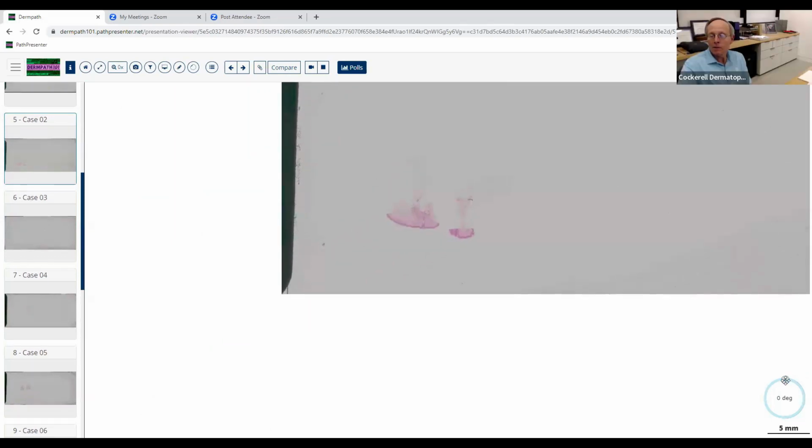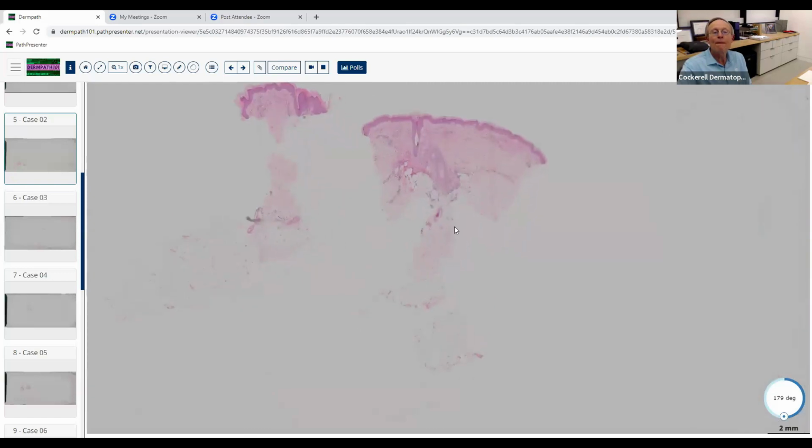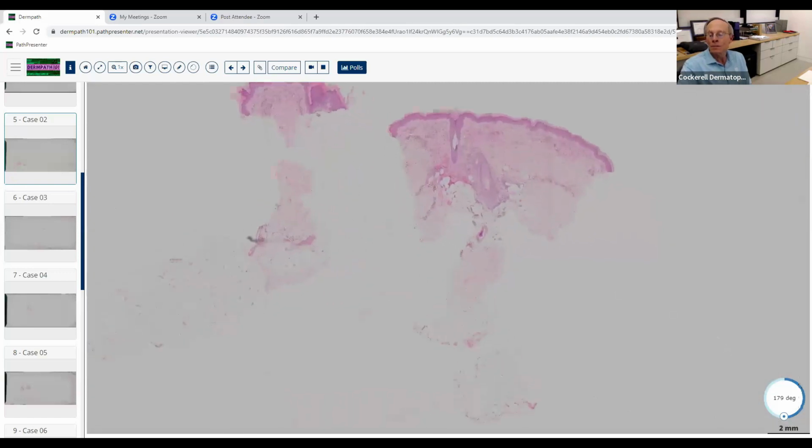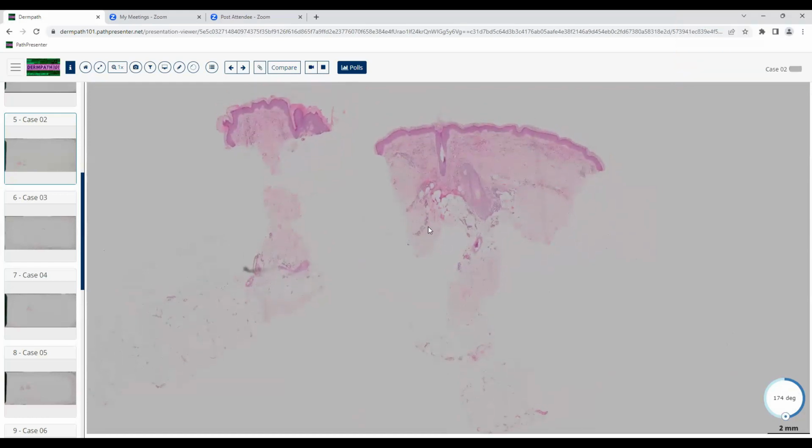Okay, so let's turn this one over on its side and take a look at it. All right. Different animal here, right? I can take this one. Good. I'm not going to let you go to any power higher than this for at least a couple of minutes. Well, I think from low power, it's obviously a punch.